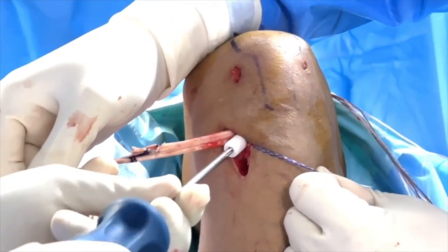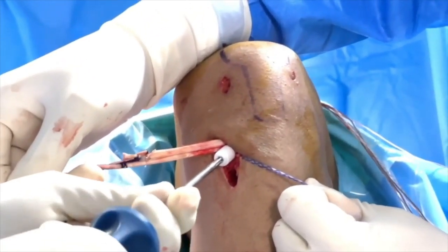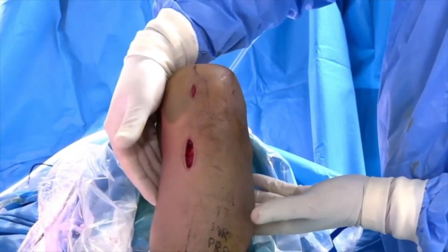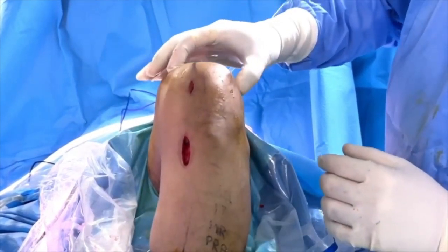Graft tension is checked by performing a range of motion test from 90 to 0 degrees of flexion. If necessary, the tightrope system is used to apply additional tension. Upon completion of the procedure, a thorough examination of the tissue indicates no noticeable swelling in the knee area.